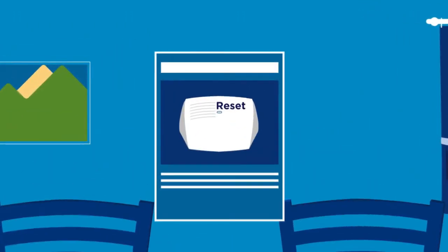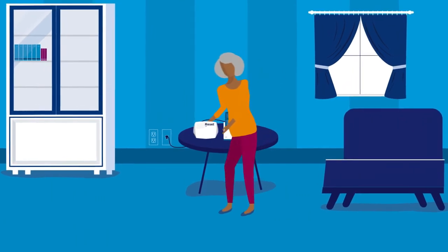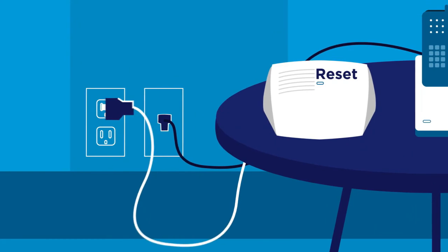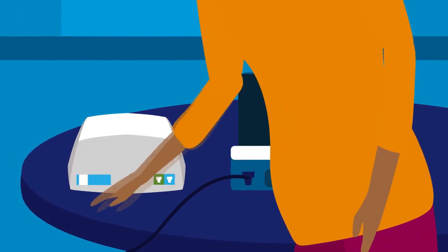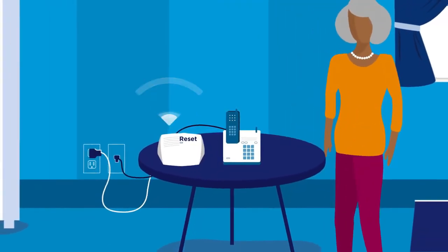Please take a few minutes to read through the manual. Place the home communicator in the room where you spend most of your time. Plug the home communicator's power cord into an electrical outlet. Then slide the power switch on the back of the home communicator to the on position. The home communicator will say, good, we detect power.